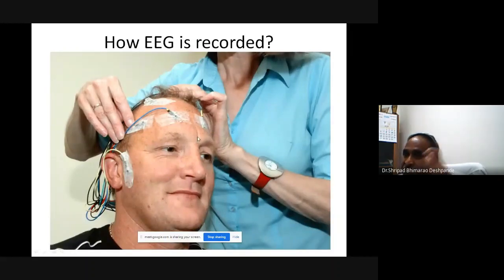The old method was much more complex. Now it is the second old method. You have those electrodes placed here, and these are taped in different portions. When you are placing these electrodes, you have to take a lot of precautions so that they make a very good electrical contact, because there should not be any grease or oil left here. Once you have done that, you have these cables. These are highly flexible and they should not be rigid. If they are rigid, they will just come away.